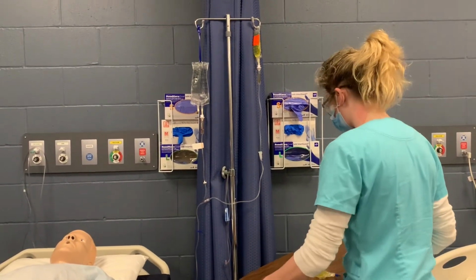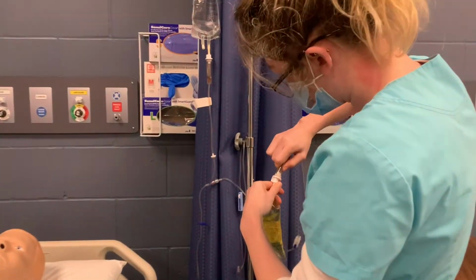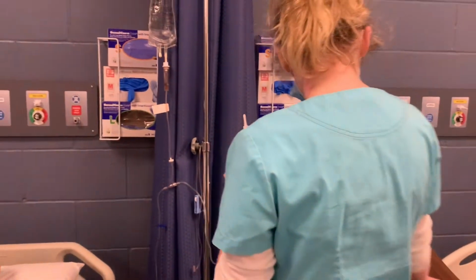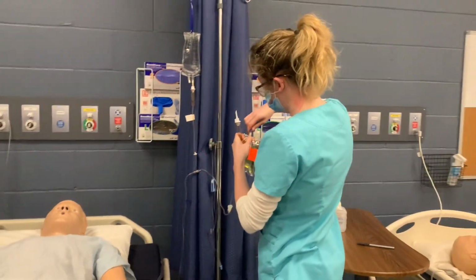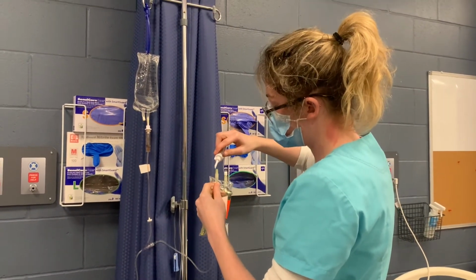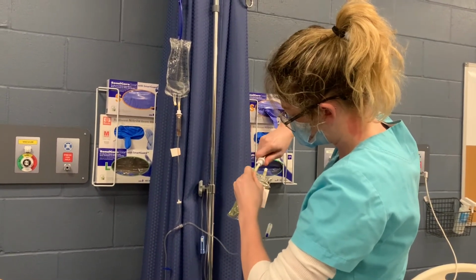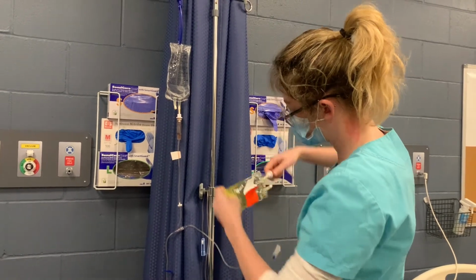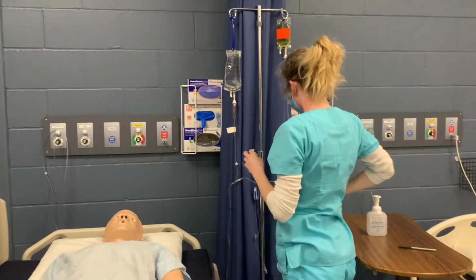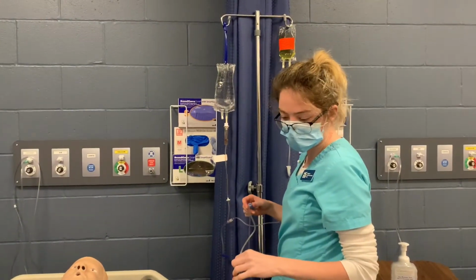I'm going to remove this tubing, invert it so I don't get medication all over myself, remove it, discard, and then remove this blue tab, being very careful not to touch any of this because it is sterile. And now that it's attached, I would normally attach it to him, but because it's a doll, it wouldn't run.